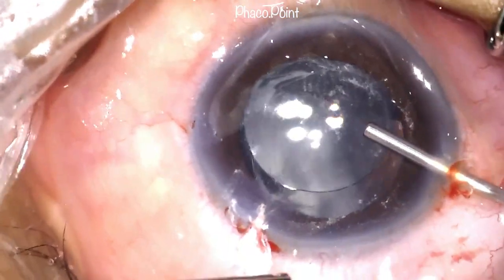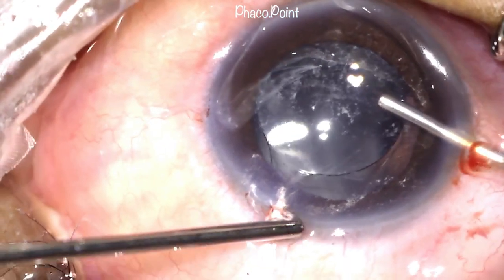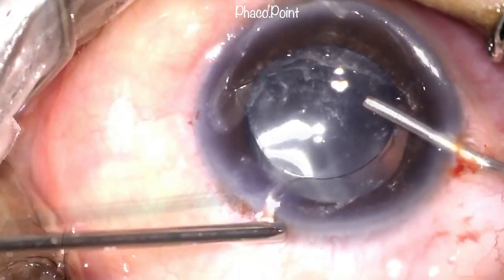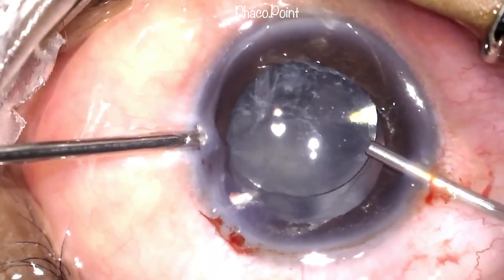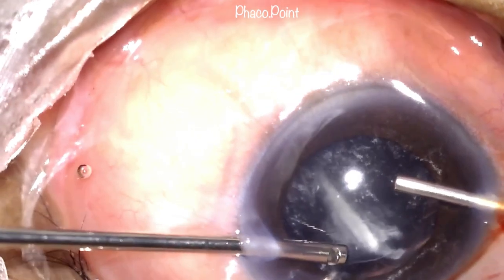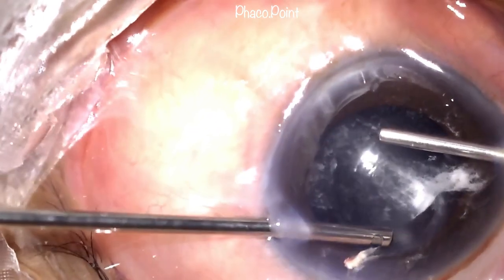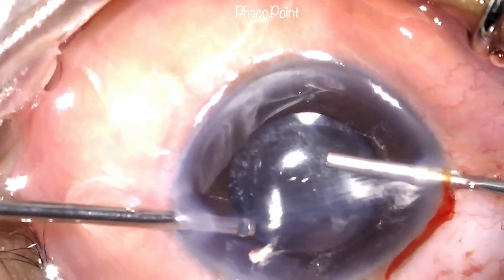You will now be able to visualize the anterior vitrectomy procedure. We start with cutting the vitreous, which is outside the wound, then within the wound, and finally within the anterior chamber. The anterior vitrectomy settings that we use here are a cut rate of 700 cuts per minute and a vacuum of 150 millimeters of mercury.